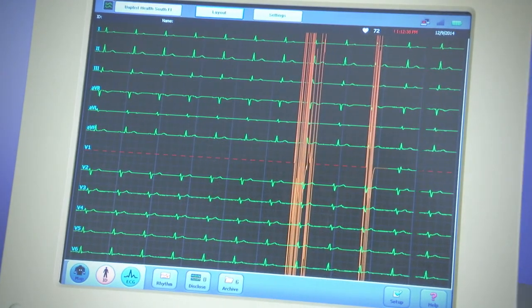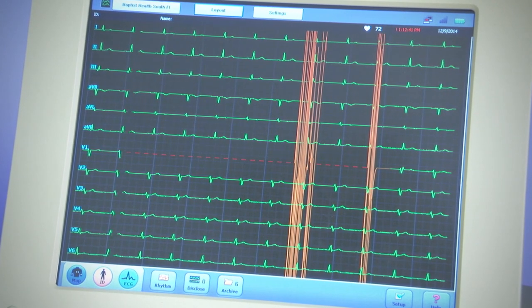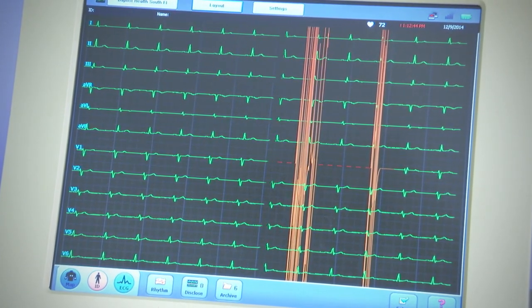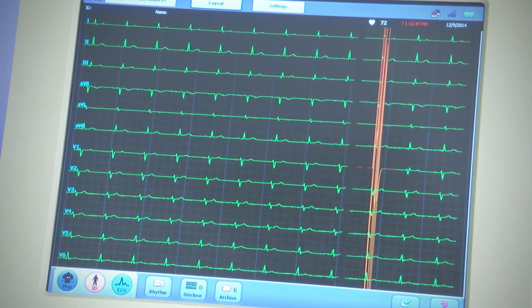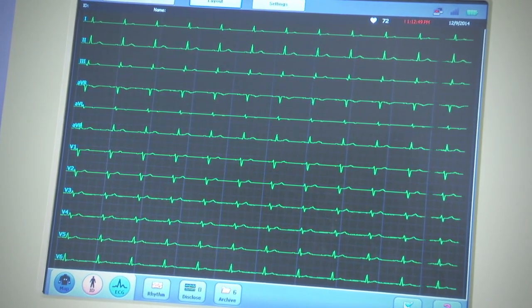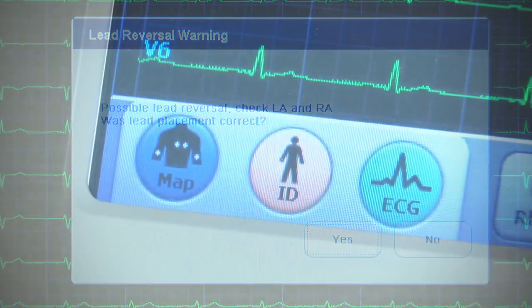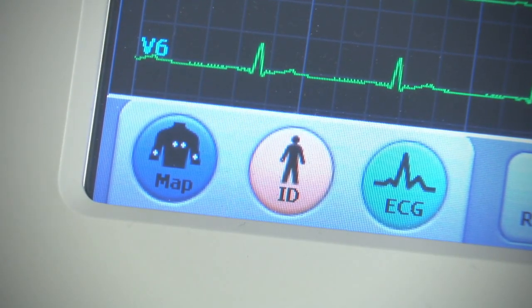All leads are displayed on the PageWriter TC screen as the patient cable is connected. Leads are color-coded green, yellow, or red and show individual lead quality. Lead reversal warnings appear in a pop-up window.